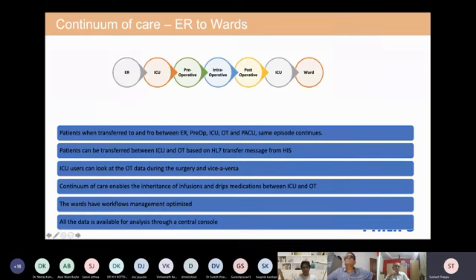This is something I'll put out there to tell you what is happening in terms of continuum of care. Typically a patient moves from, let's say, an emergency room to an ICU, or a preoperative, intraoperative, postoperative setup, back to the ICU and then to the ward, right? So the idea is to maintain data across this continuum, and that happens through different channels. For example, Chris also pointed out that infusion pumps now are coming with a lot of connectivity options. You don't need a central station for any of those options. They can directly send the data to a central server, and that central server is intelligent enough, through Centricity for example, that this data can be stored in context, and then presented in context later on as well. So, right from infusion rates to drugs and interactions, along with patient condition and care area, all of these things get combined at the central server level.